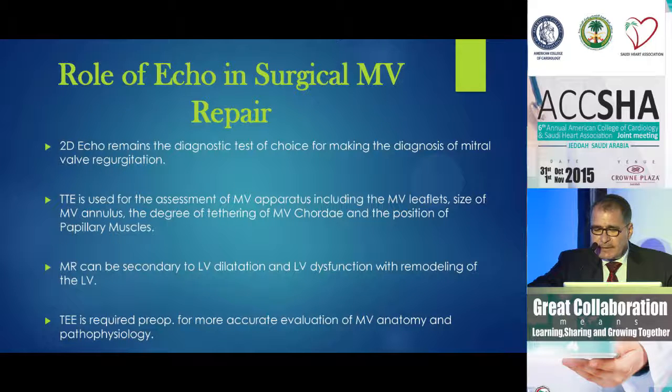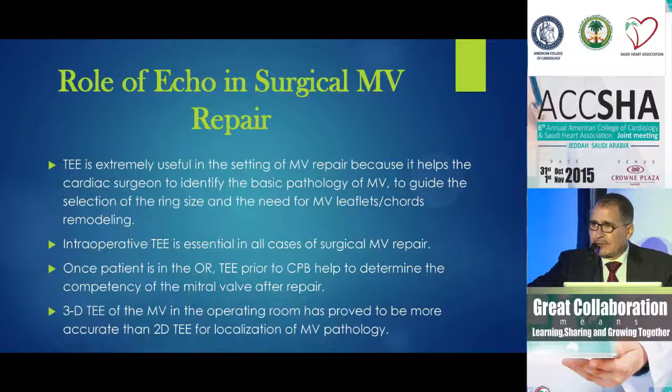Things actually got even better. Not only TEE, that was 2D TEE, now 3D TEE has been introduced for at least 5 or 6 years in so many laboratories.